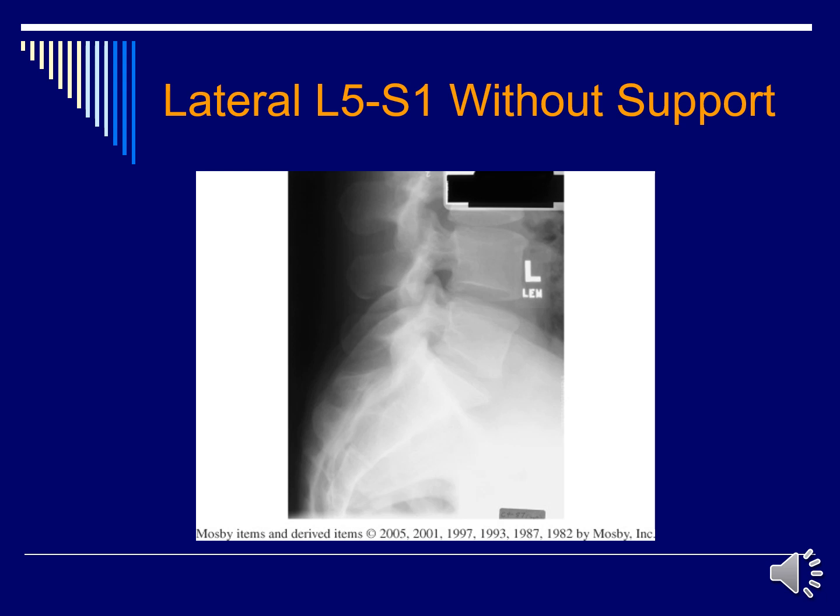Rotation is when I am showing the zygapophyseal joints in the intervertebral foramen. So if you look at the area between L4 and L5, you can see the superior articular processes within the intervertebral foramen, which means that this patient not only has a sag on their back, but they also have rotation on their hips. So ensure that you are properly positioning your patient so you do not have to repeat.